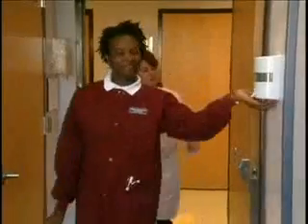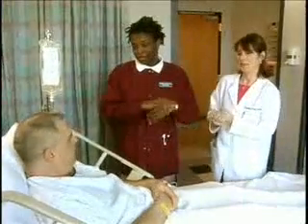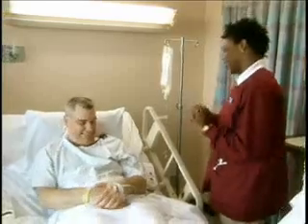Hi, Mr. Conway. How are you? Mr. Conway, this is Ms. Swenson, my instructor. She'll be observing as I check your IV infusion and change the fluid container. Is that okay? Not a problem. Changing the oil, eh? That's right. I'd like to see your ID band. I'll check it with the MAR. And what is your name? Dan Conway. Good. And I'd like to be filled up with premium, not regular. We'll take good care of you.